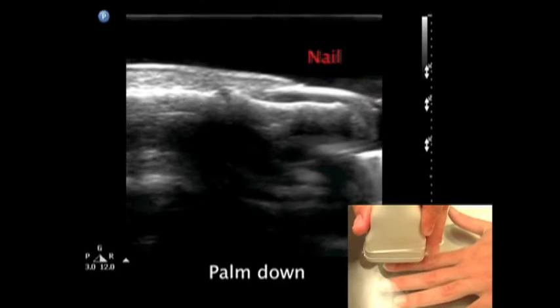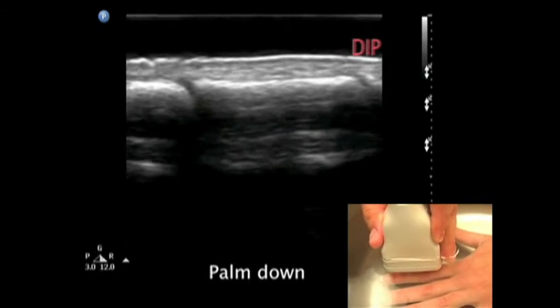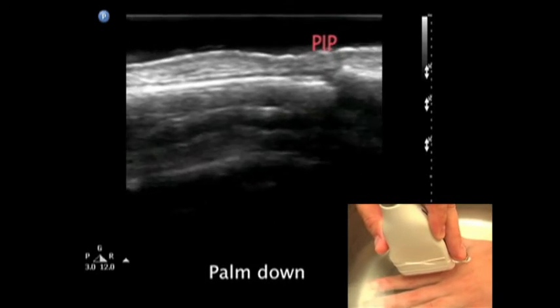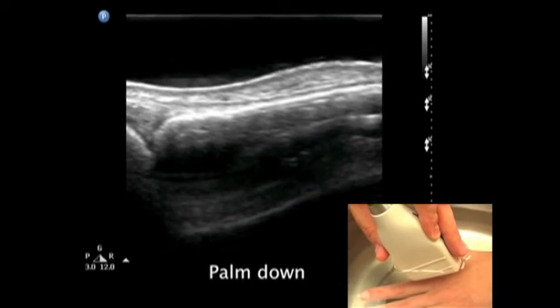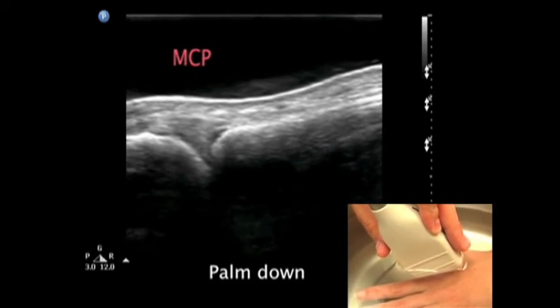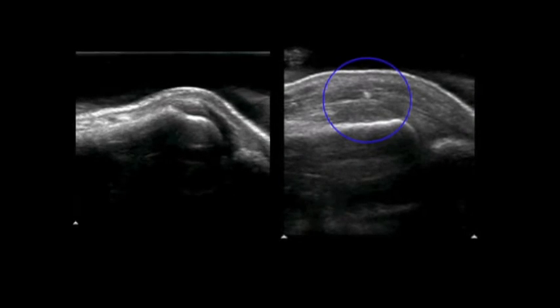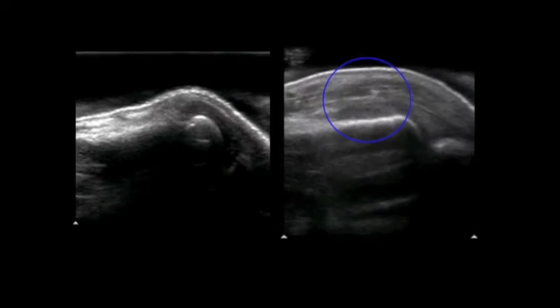The nail is identified near the tip of the finger. Scanning proximally, first the DIP and then the PIP joints are seen, with the extensor tendon running as a thin white line across the bones. Scanning more proximally, the MCP joint is visible. On the left side of the screen is a normal MCP joint, with the extensor tendon sliding across the joint.